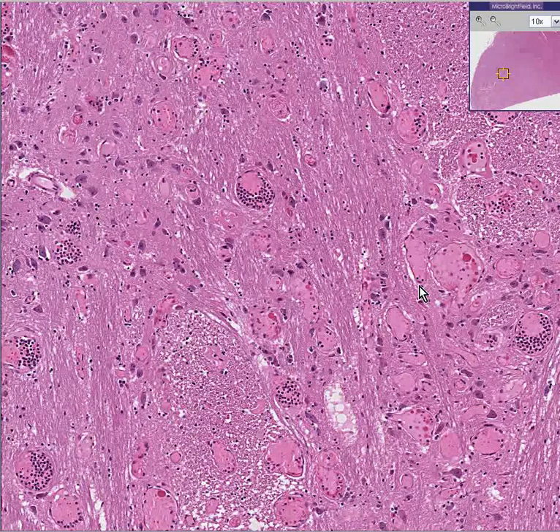An AVM in connective tissue would not normally be very much of a concern. Classical arteriovenous malformation. In this case, it happens to be in the pons.